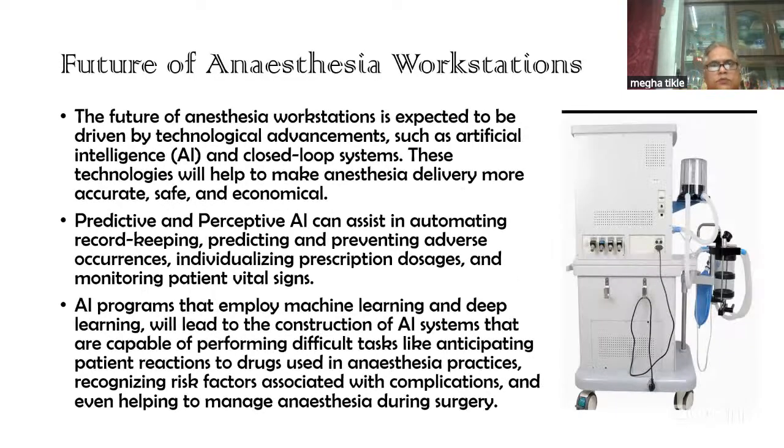Now, coming to what the future holds for us in the anesthesia workstation. As I think of it, most of the workstations will now be driven by technological advancement such as automation and closed loop systems. This will make anesthesia more safe, accurate, and economical.